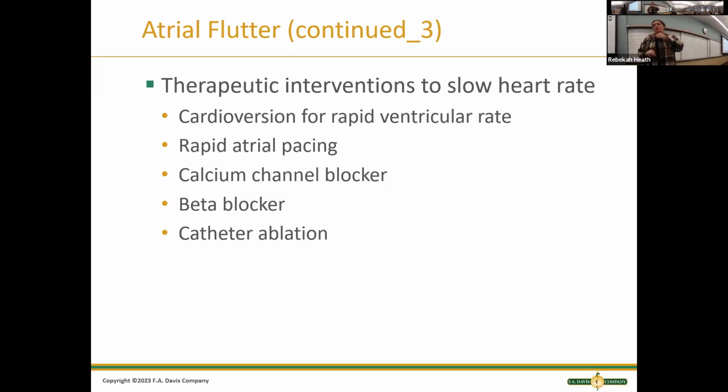And we don't have to choose the timing. I'm so thankful. Years and years ago, we would have to look at the signal, because what you don't want to do is push a big electrical impulse right as the ventricles are contracting, because we might totally malfunction the heart and the patient might die. But now we have the machine pace it out so it doesn't give that signal at the wrong time. It's not very comfortable to patients.